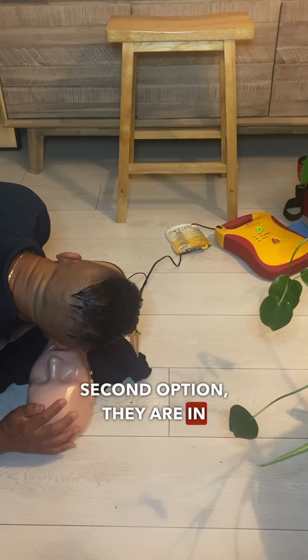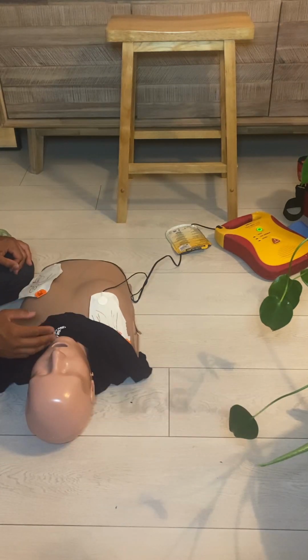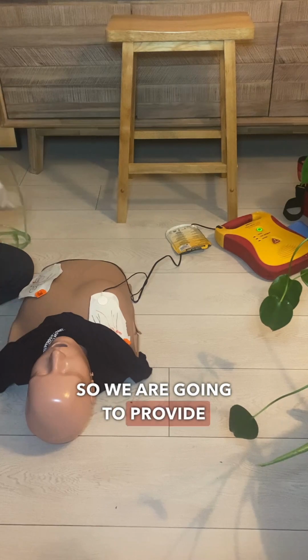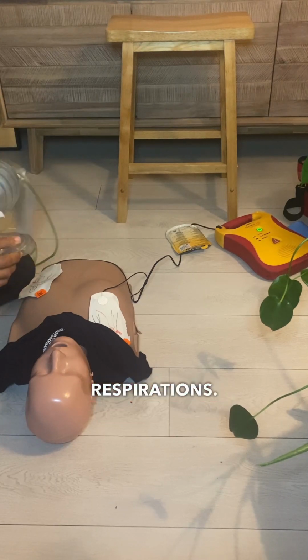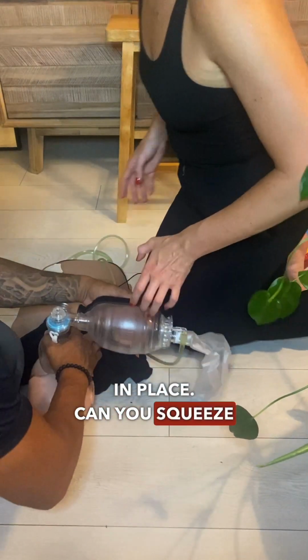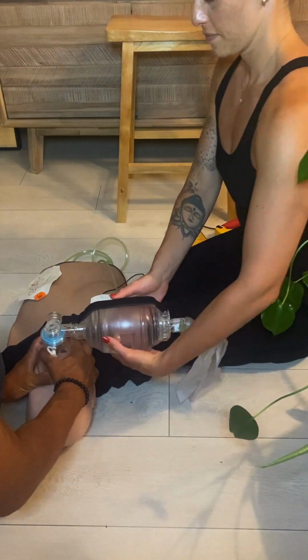Second option, they're in respiratory arrest. Solution, provide assisted ventilation using bag valve mask, 1 breath every 5 seconds. So we are going to provide assisted respirations. So I'm going to hold the mask in place. And you squeeze 1 breath every 5 seconds. So squeeze a third of the bag.